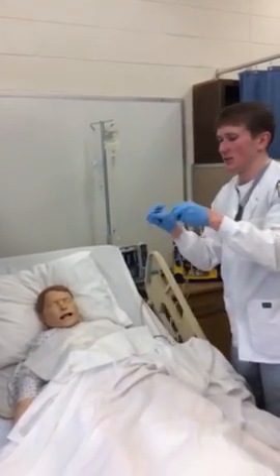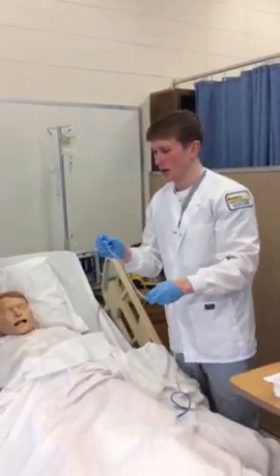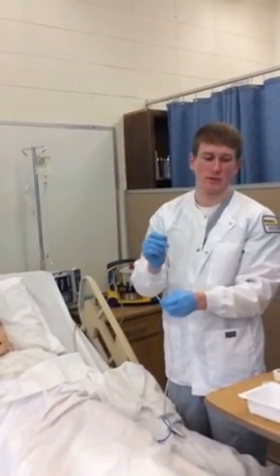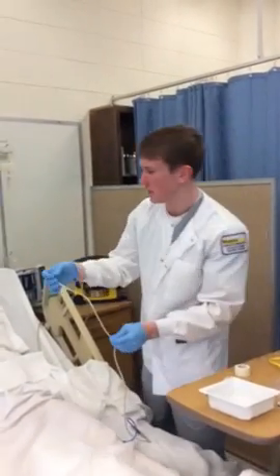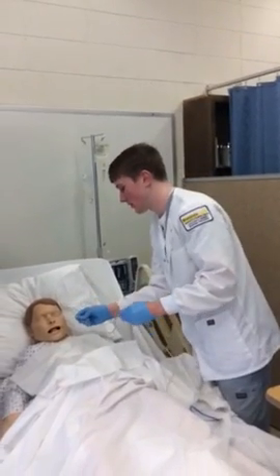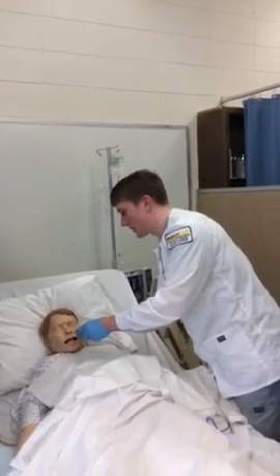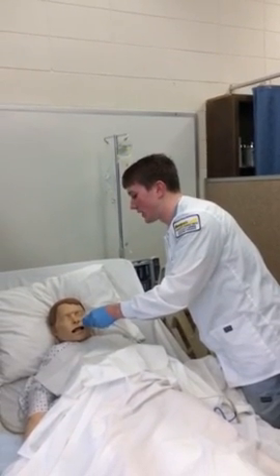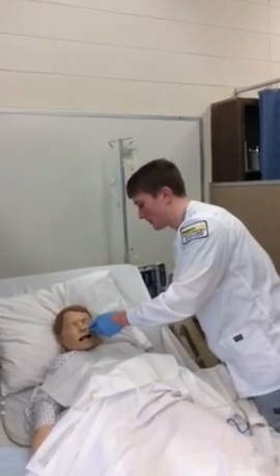And now that I have that length, I would mark the tube with a marker and then lubricate 2 to 4 inches of the tube with the lubricant I put in here. Then instruct the patient to tilt their head back on the pillow. So they do that, and then I enter gently and say, once I reach the back of your throat and you feel it hit back there, just give me the stop sign. And I insert 1 to 2 inches at a time.